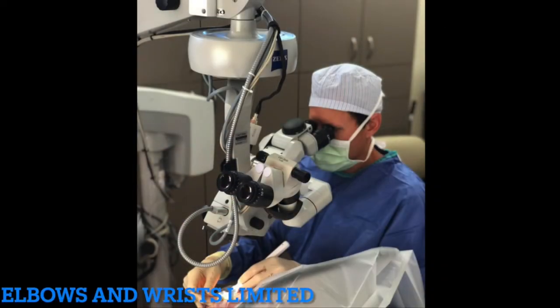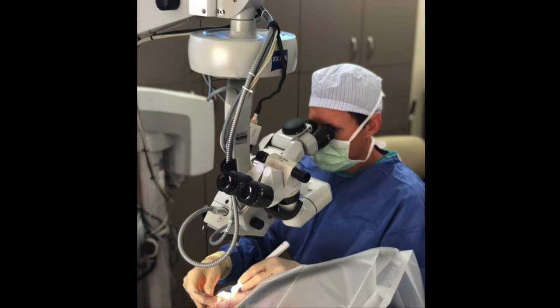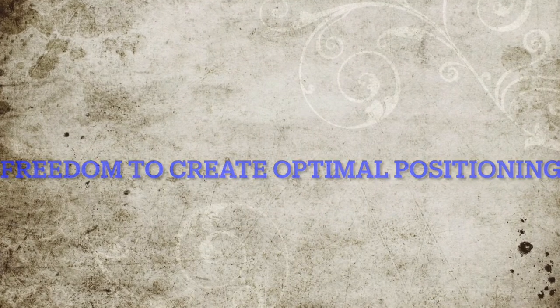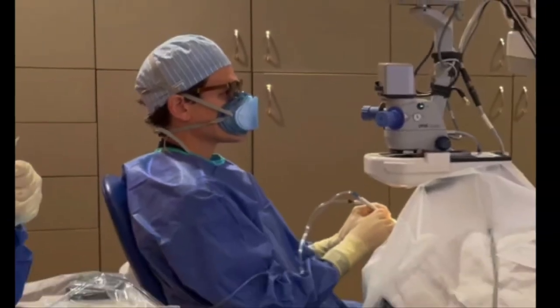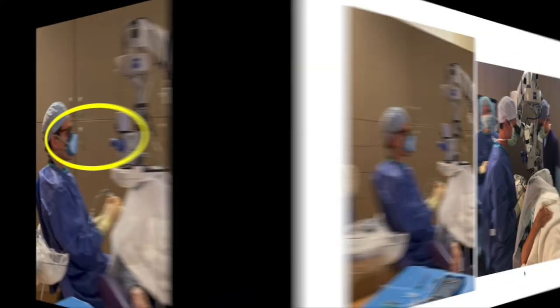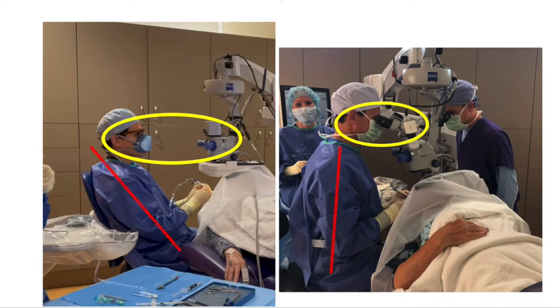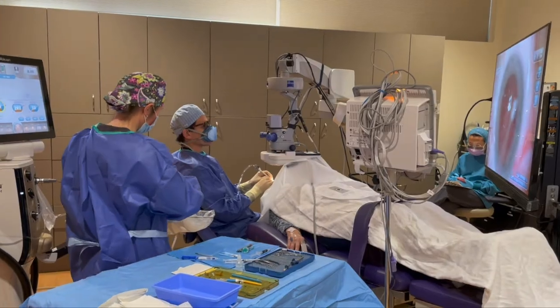It required me to sit forward. My elbows and wrists were somewhat limited in positioning, and certain patients made it more challenging due to the way they looked. Now I'm uncuffed from the oculars; I can sit back in any position I need to. I'm more like 16 to 30 inches from the microscope. You can see my back position as well.